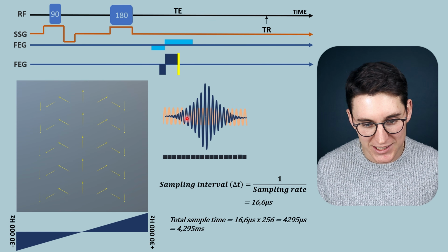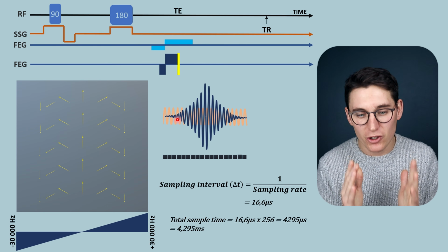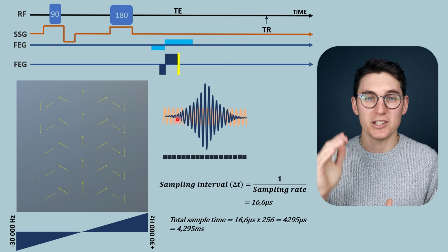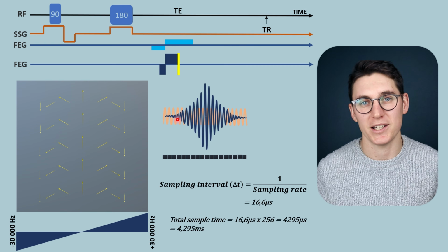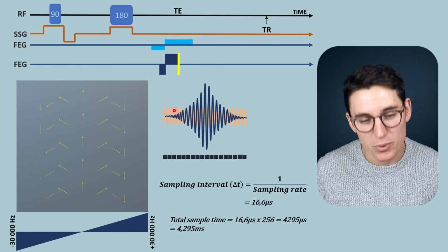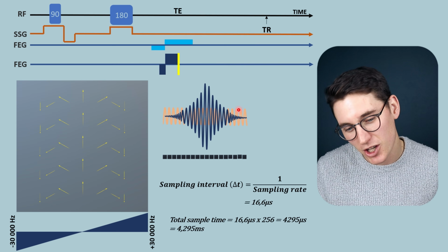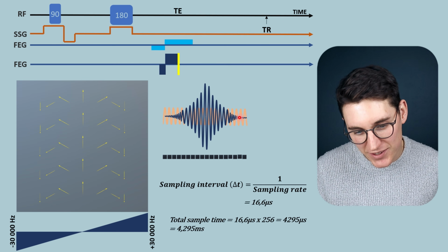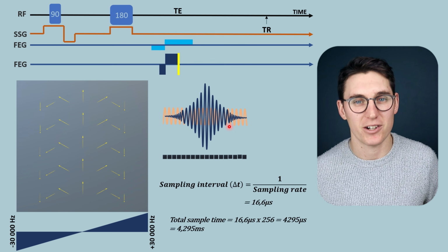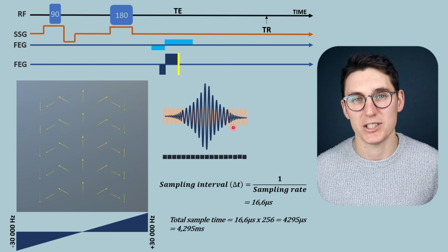Now hopefully you can see that firstly, the data acquisition period is much shorter, because our sampling rate needs to be much faster. We're still taking the same number of samples as we did in the previous example, but we're taking them much more quickly. And we can also see that when we start taking those samples, the noise predominates, then signal takes over, and at the end of this data acquisition, noise predominates again. If this is me whispering here and this is background noise, you can't really hear me over that background noise. In the previous example, our signal matched that of the noise. There's a better signal-to-noise ratio.